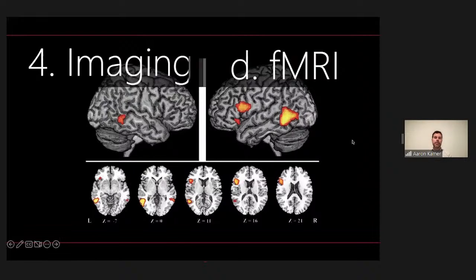Functional MRI can certainly be used for epilepsy. Resting state fMRI is something that can show us areas that are either not well connected with the rest of the brain and may therefore be a little bit dysplastic. It can show us areas of a little bit atypical electrical activity that's happening in the brain, or activation that's happening in the brain.